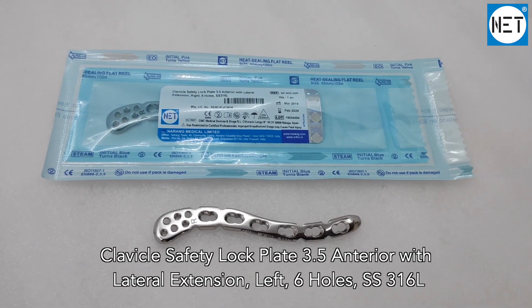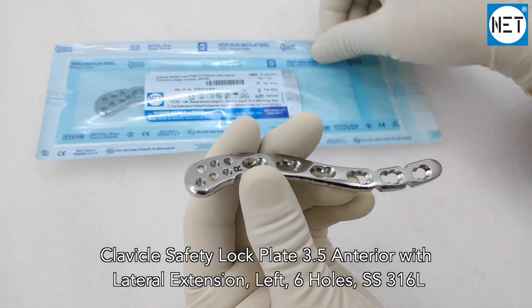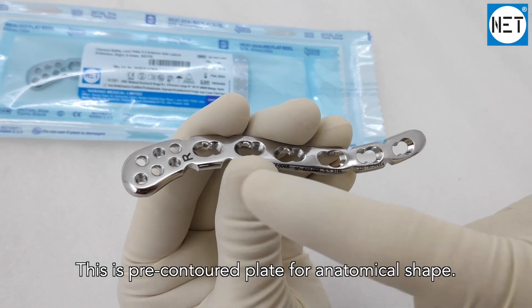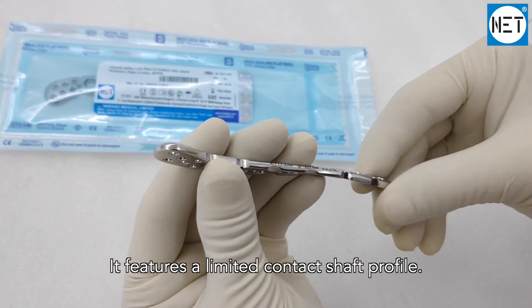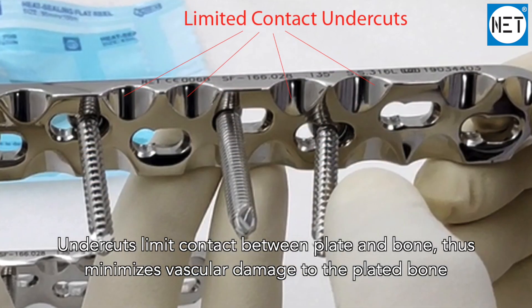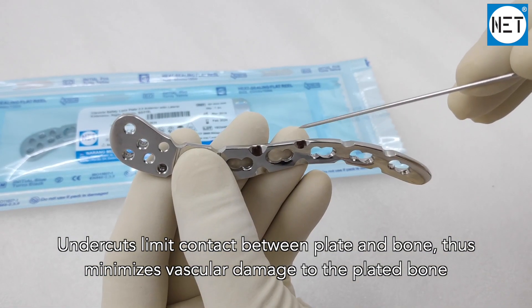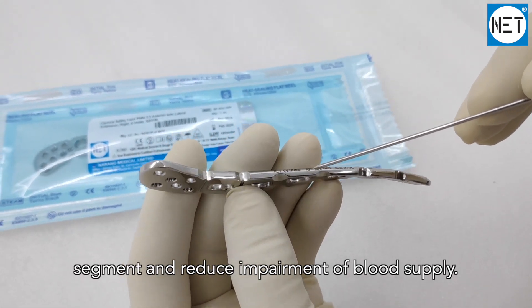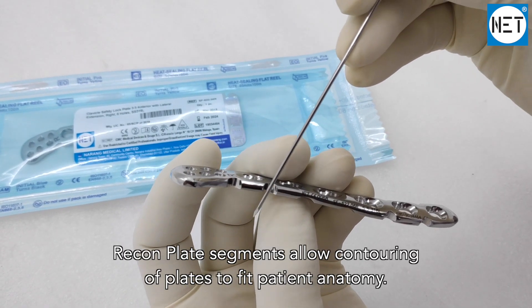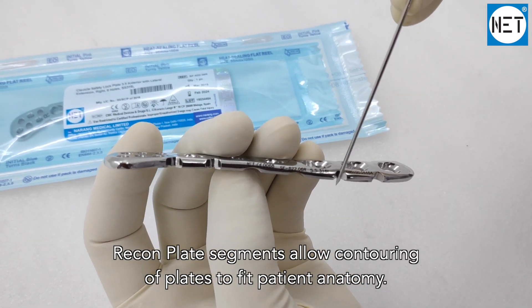Clavicle safety lock plate 3.5 anterior with lateral extension, left, six holes. This is a pre-contoured plate for anatomical shape. It features a limited contact shaft profile; undercuts limit contact between plate and bone, thus minimizing vascular damage to the plated bone segment and reducing impairment of blood supply. The recon plate segment allows contouring of plates to fit patient anatomy.